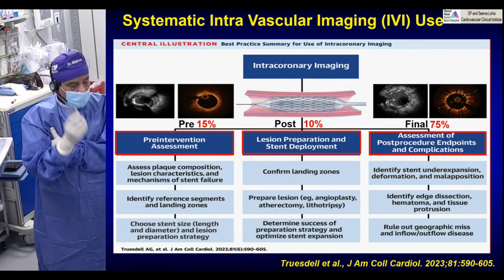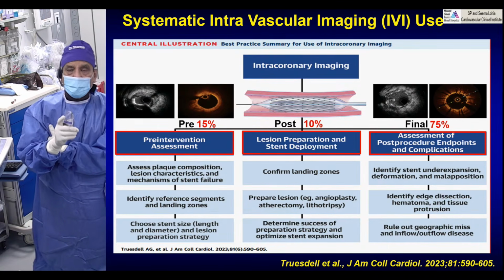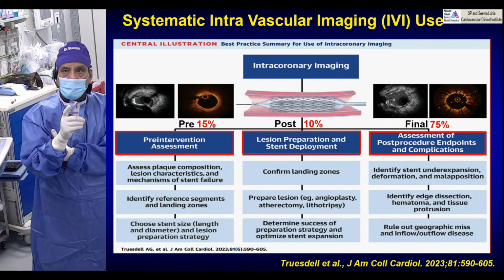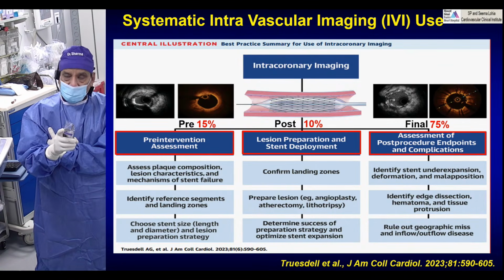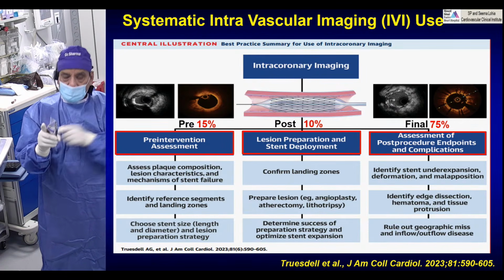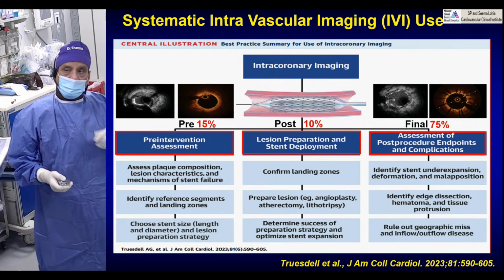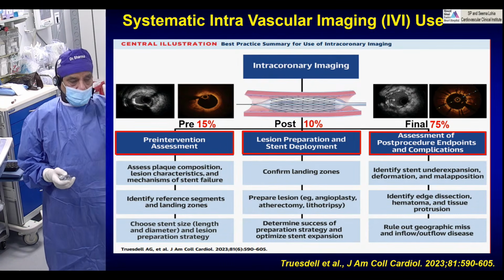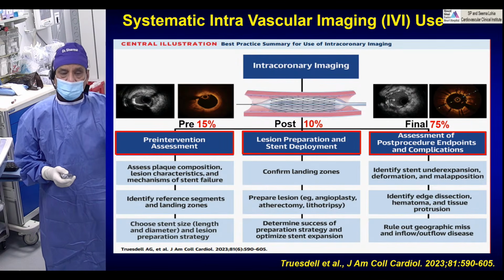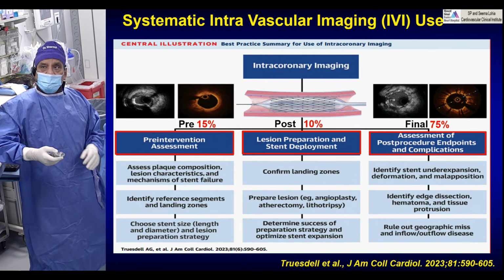Now, the point is, in America 4 years ago, in 2022, use used to be 5 to 8%. Now, in 2025, we don't have the data for 26, end of 25 became 28%. Imaging, not IVUS only, intracoronary imaging or intravascular imaging. Now, where we'll go, we'll figure out. Just to emphasize once again, the highest use of intravascular imaging is in Japan. There are 90+%, all the interventions are done using intravascular imaging.